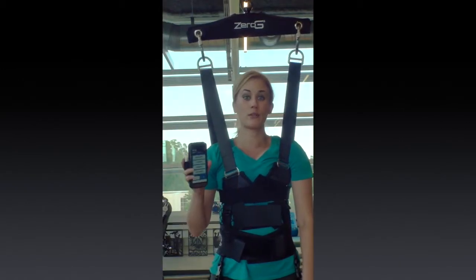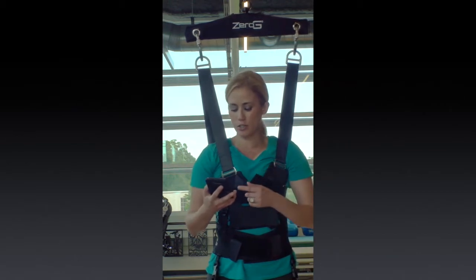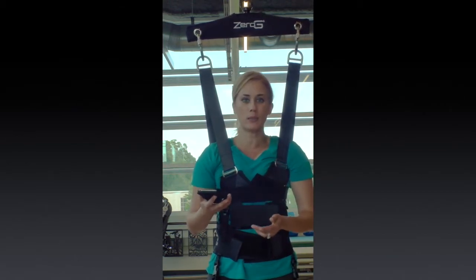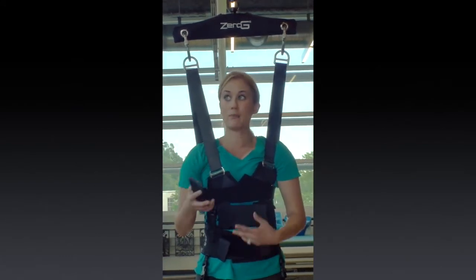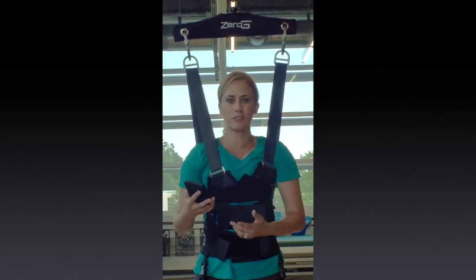Now I'm going to do a few things with the remote in my hand. This is what lets me change the level of body weight support at the touch of a button. I can change the fall settings. I can do all sorts of things to keep myself in control and just change things on the fly with the remote.